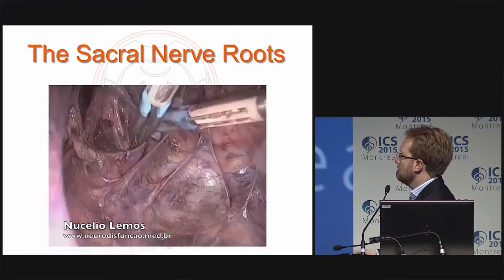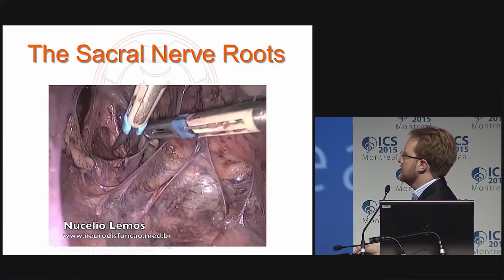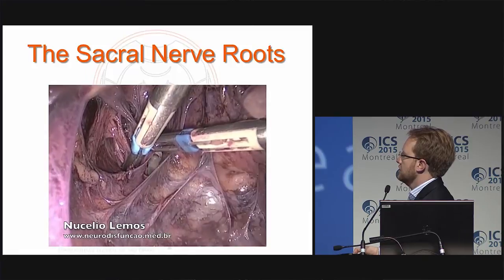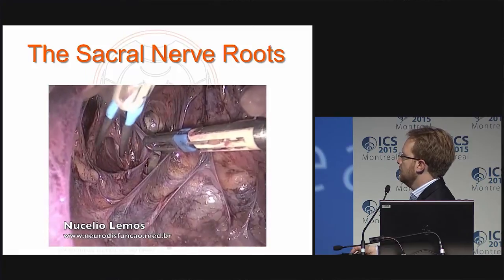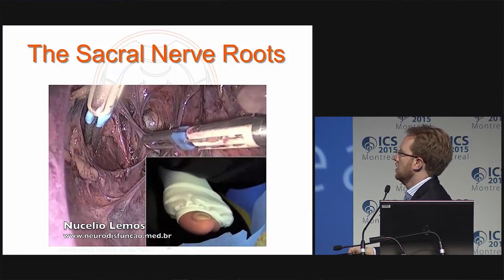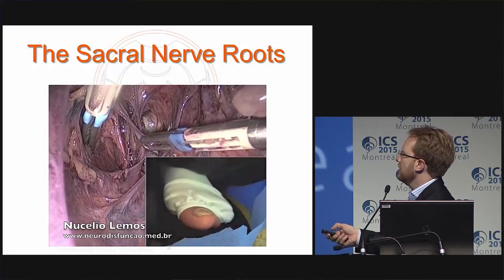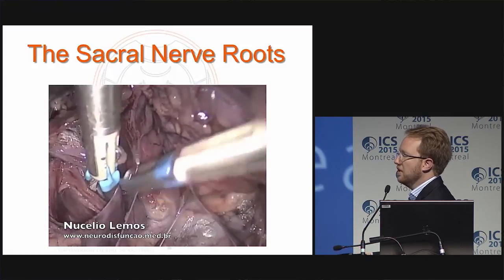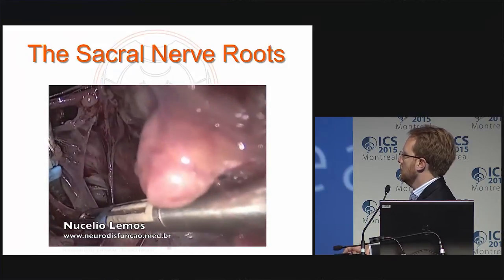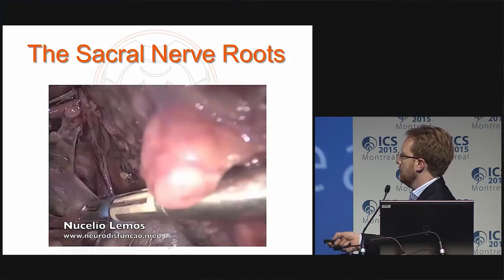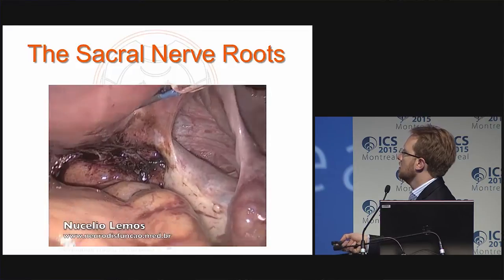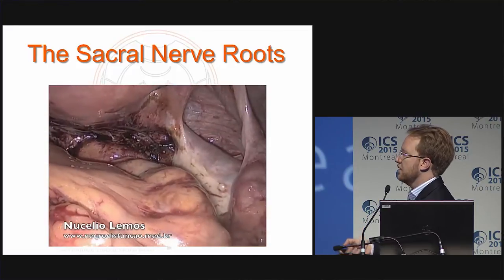We can use intraoperative neurostimulation. This is S3, this is S2. With S3, we can induce pelvic floor contraction, much the same way as when implanting an InterStim. We can also see peristalsis increasing and bladder contraction.